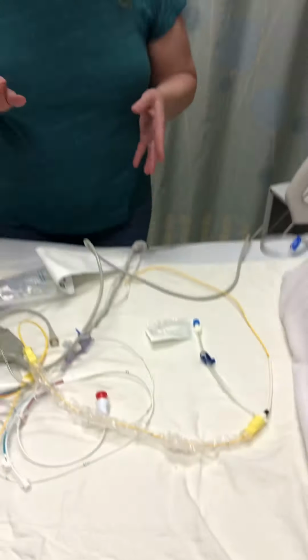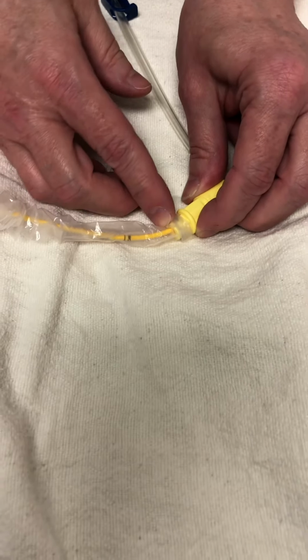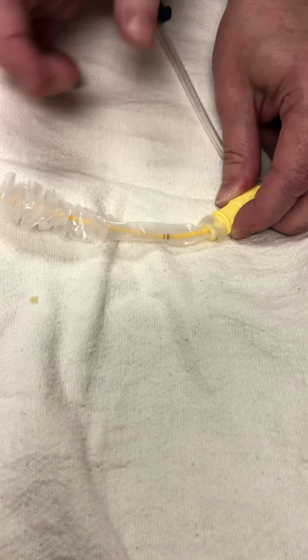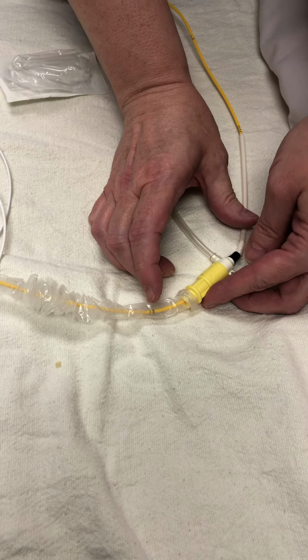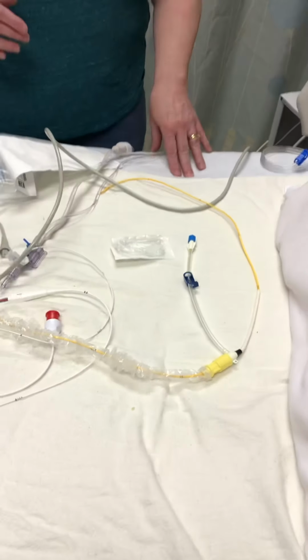So when we're measuring the insertion distance of the Swan, we are checking it right here. Where does it go into this thing? So this marking here, it's not quite 60, so you figure you're probably at a level of about 57. And that's something you want to document in Epic, and if the Swan migrates, that's important information to know. Is it in the same place? Is it a problem with your equipment? Or do you think your Swan actually has moved into a different place?